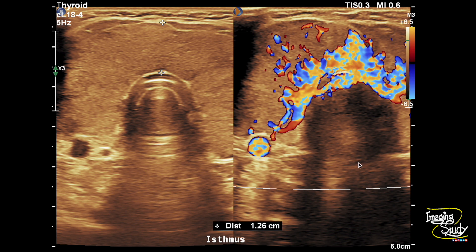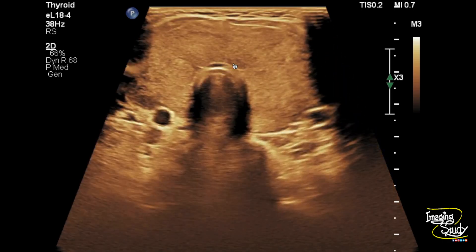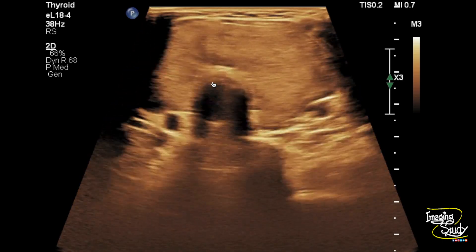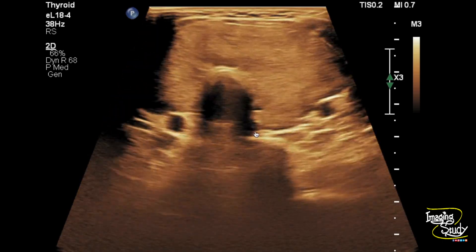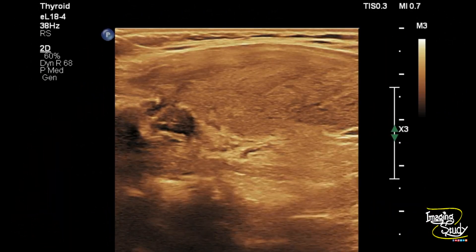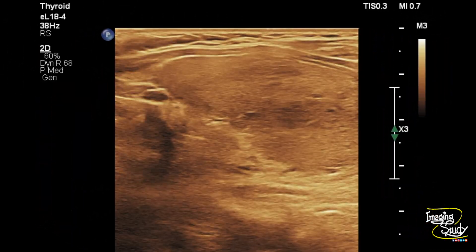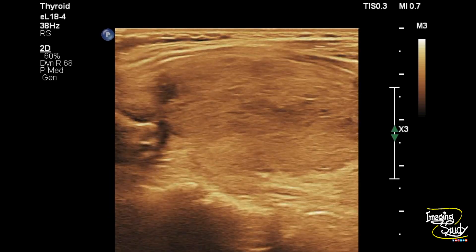We'll talk about the Doppler findings a little bit later. Let's look at the real-time video. Here you can see the transverse section of the thyroid gland, which is heterogeneous and diffusely enlarged. This is the tracheal ring, and these are the carotid and jugular vessels. Here's the longitudinal section of the right lobe showing diffuse enlargement and heterogeneous echotexture. Here's the left lobe, which is also enlarged and heterogeneous, but no definite solid or cystic nodules are seen.